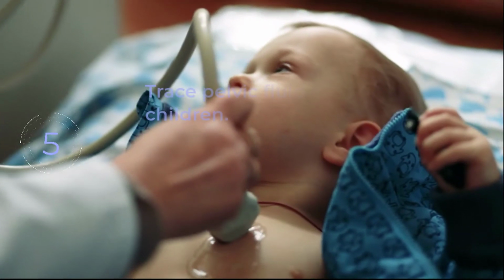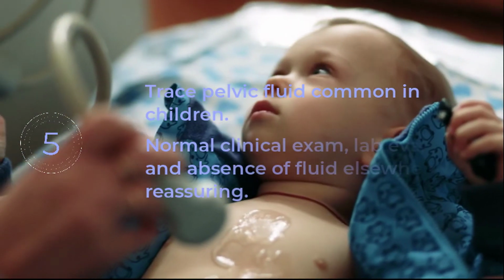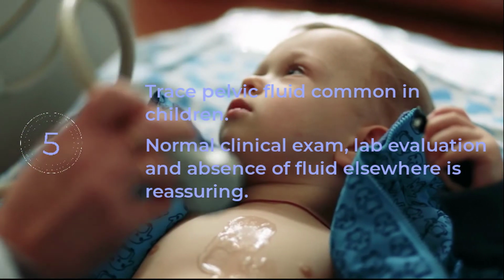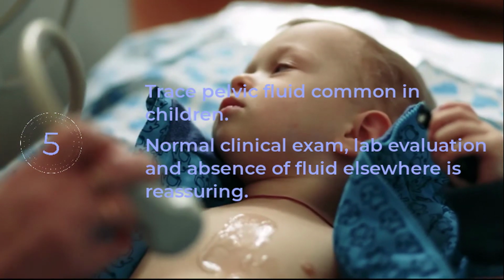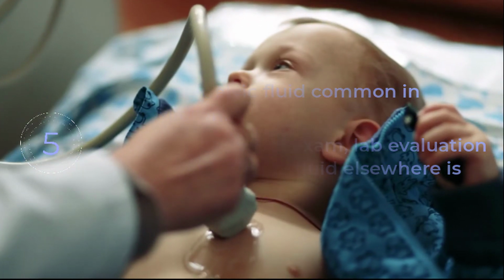Many healthy children have trace pelvic fluid. Repeat your scan, correlate it with the remainder of the exam and lab findings. Evaluate for fluid elsewhere. If your patient has isolated trace pelvic fluid and their physical exam is otherwise reassuring, the finding is most likely incidental.